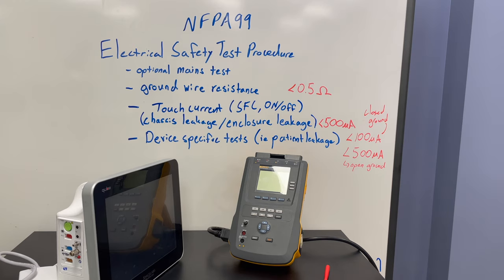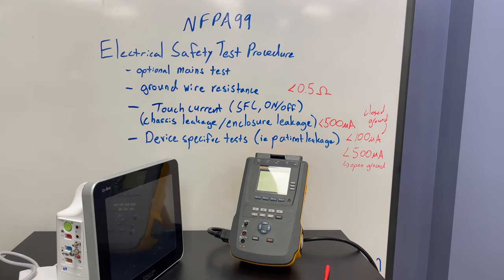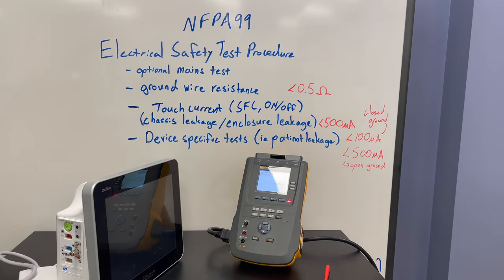We're going to go ahead and do all the safety tests that we would normally do in our electrical safety inspection. One thing that's different with the Fluke ESA-612 is it has a power switch, as opposed to the ESA-609 which you just plug in.